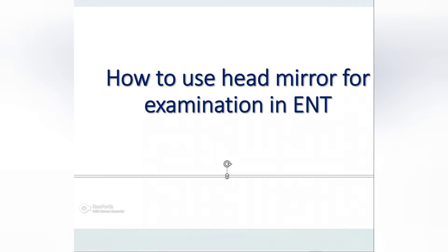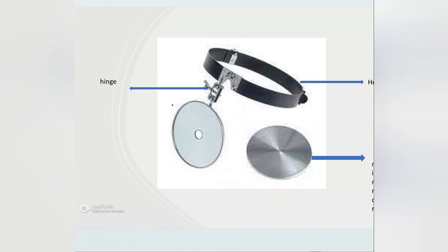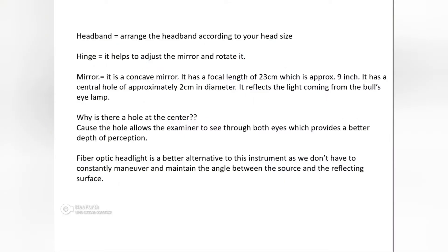Let's get started with the head mirror. This is what a head mirror looks like. First I'll explain theoretically and then show you a video as well. Here is the headband, then this is the hinge — it helps to rotate the mirror and put it in a proper position. This is the mirror. The headband can be arranged according to your head size, which helps to adjust and rotate the mirror.